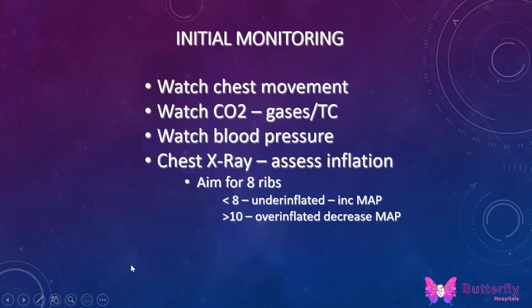As we said, once we put the baby onto high frequency ventilation, we talked about what settings we want. One is the mean airway pressure, another is the amplitude of ventilation, which is delta P, and also the frequency of ventilation, and we adjust the oxygenation based on the FiO2 as well. To adjust the oxygenation, both mean airway pressure and FiO2 alter the oxygenation. Amplitude and frequency are for targeting the CO2 clearance.